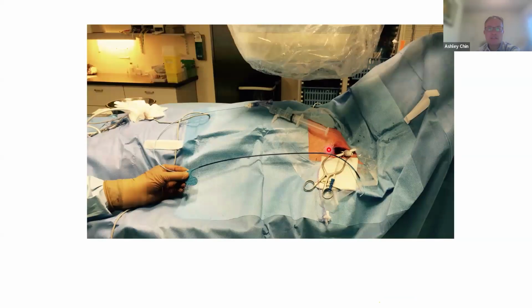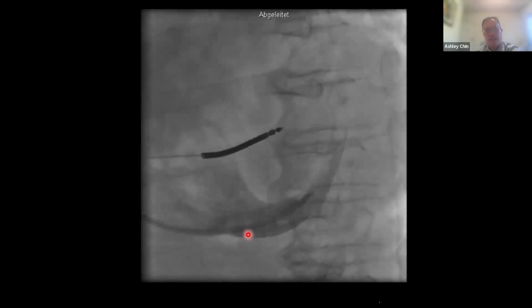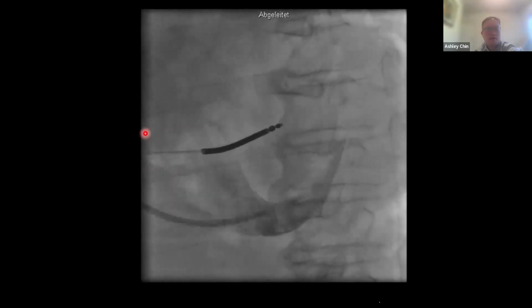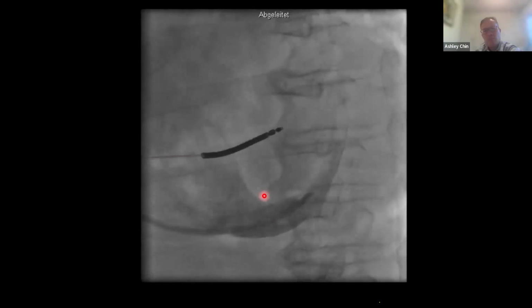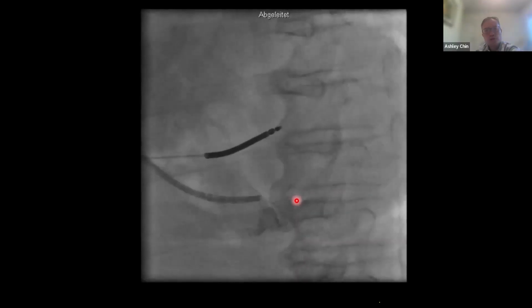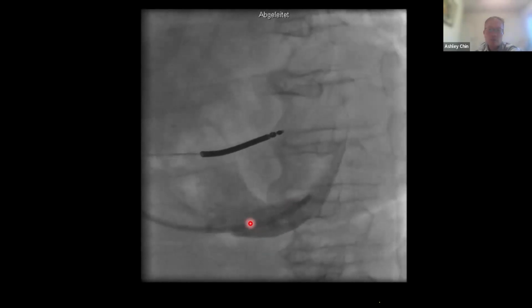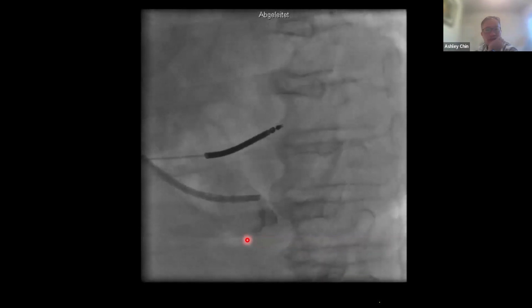All right, so the CS cannulation without a steerable catheter. Here's an example of how you would do it. Here's a Biotronik sheath. Here's an inner coronary catheter. And so this is another technique that you can use. I don't use this anymore. I find sometimes that you might end up using quite a lot of dye. You can imagine the Thebesian valve being here. It's quite difficult sometimes to advance it across. But certainly you could use this if you decide not to use the CS catheter.